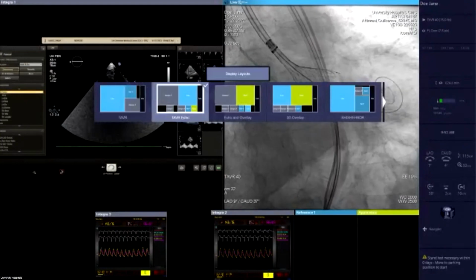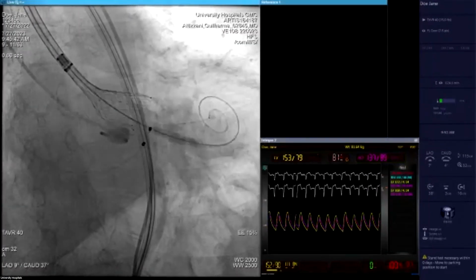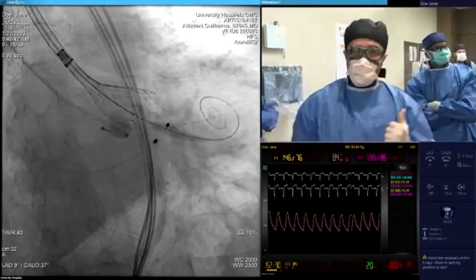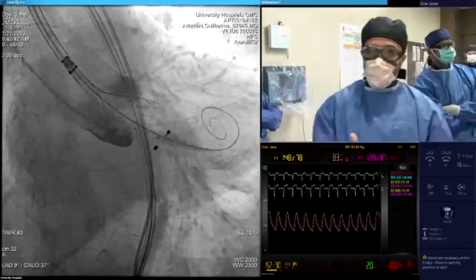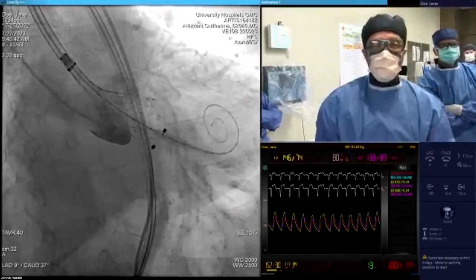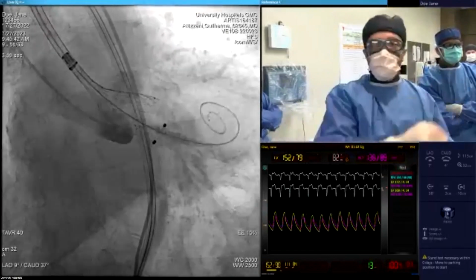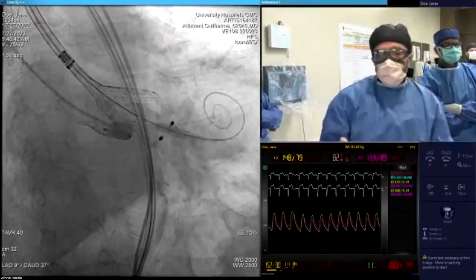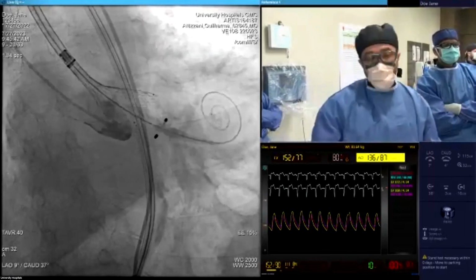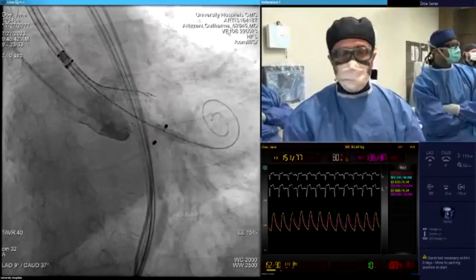And final message here: every time we need to recap, the recapturing device feature is excellent. Every time we're going to recapture the valve when the valve is deep, just like it was here, for multiple reasons, obviously, tortuosity, tension, horizontal, bicuspid, right? Try to always pace. It's important to pace so the valve does not get ejected to the aorta. And then, the partial recapture happens much more smoothly than it would. Otherwise, you have to full recapture and restart from scratch.